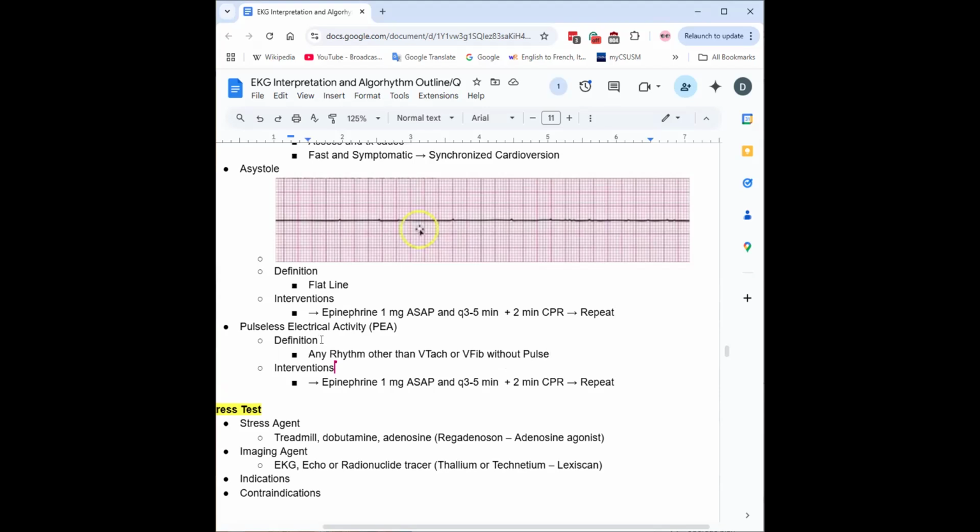That's why it's especially important to check your patient, because you might be sitting there at the monitors looking at it. Oh, they're in normal sinus rhythm, heart rate 70 something. They're beautiful. And then you walk in the room and they don't have a pulse.